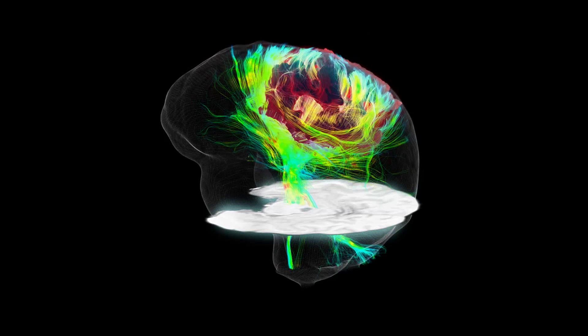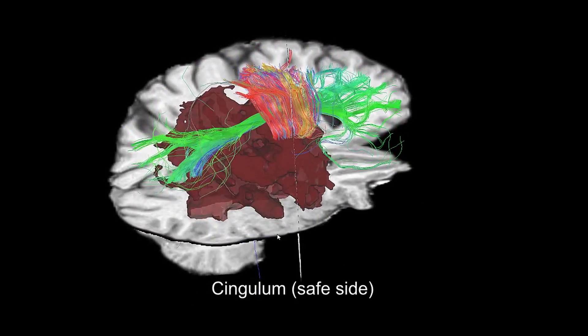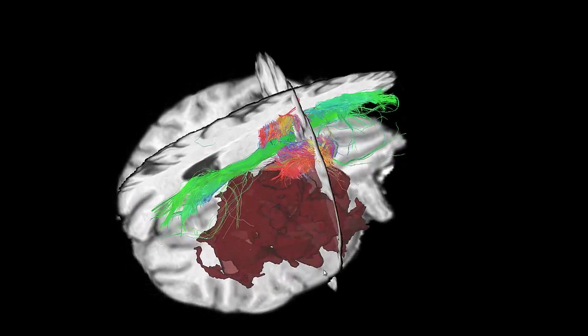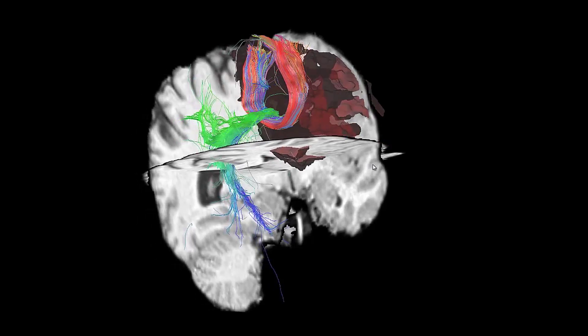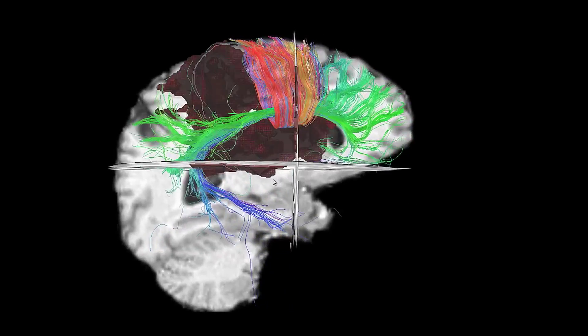This is just the introduction to the image we were looking at. Now you're in a side view on the healthy side. You see the cingulum bundle and the corpus callosum that looks healthy on the non-tumor side. This greenish fiber looks fine — it's a big U connecting the temporal lobe and the frontal lobe.